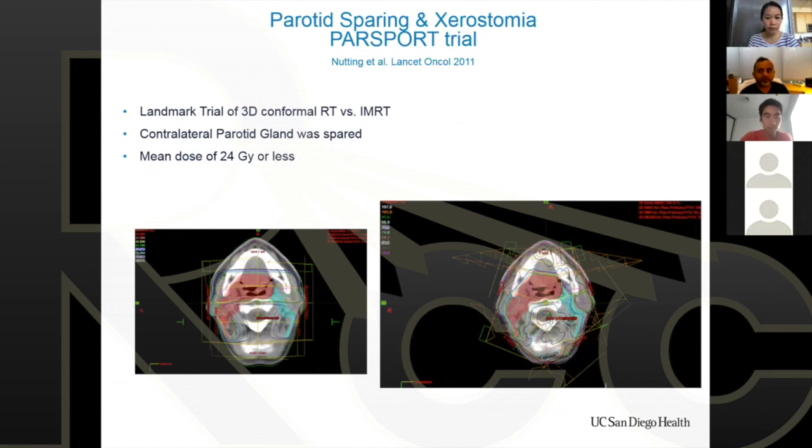This trial came out in 2011, and this is the only trial of its kind to really look at 3D conformal radiotherapy and IMRT. So you can see I am old enough to have planned head and neck cancers with 3D conformal radiotherapy. I don't know how many of you do this on a routine basis, but you all remember you basically had these opposed laterals treating the majority of your upper head and neck, and then you had an anterior matched supraclavicular field treating the low neck nodes.